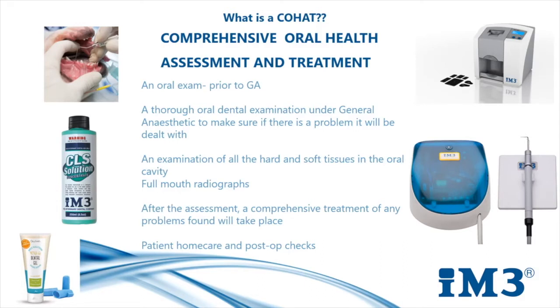If we can, an oral examination prior to any anaesthesia makes it easy to identify malocclusion prior to intubation. However, then we need to go on and do a full general anaesthetic for a thorough oral exam. The patient must be under full GA and be intubated for this procedure. A safe anaesthetic must be maintained. All patients should have an IV catheter with fluids, and all their parameters must be monitored.